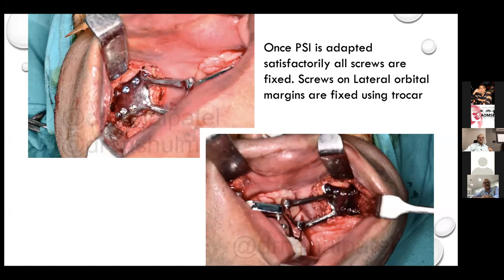So when you make an implant during the designing time, you come from basically occlusal to above. And when you place the implant, your sequence is reverse. You place an implant, fix the bar, put the prosthesis, put the patient in occlusion, and then you fix the PSI.